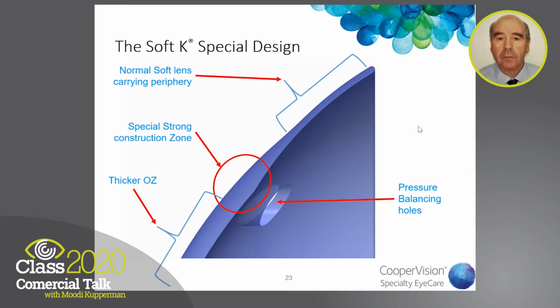Contamac has new materials. One of them is a hydrogel with 67% water content, which is a high water content, but the modulus is higher than the GM3 material or the Definitive, whose moduli are quite similar. So we have two materials that we can start working with.